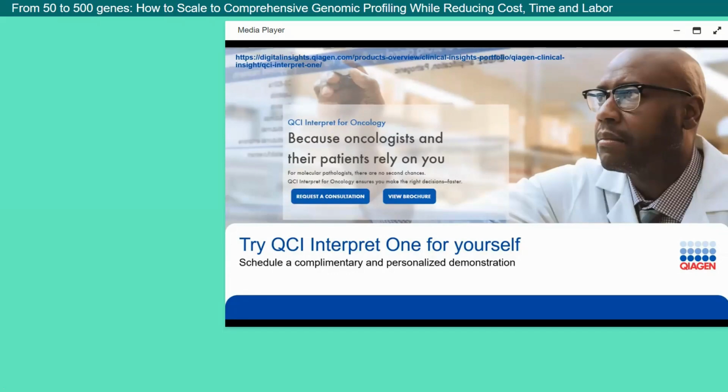And then, since QCI always computes the latest evidence, you can always see how QCI computes the variant today. So if you do that and want to then issue an amended report, basically you have a case report field that allows you to make changes there, and also add comments that this is an amended report, and then reissue that report and finalize it again.